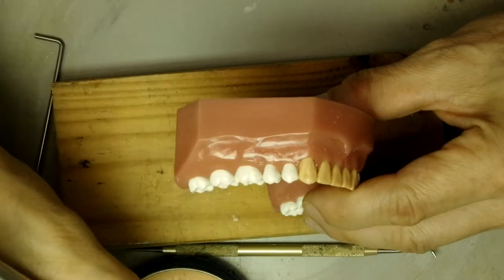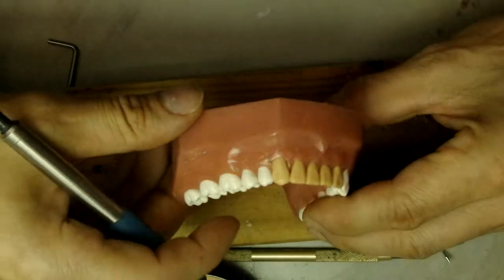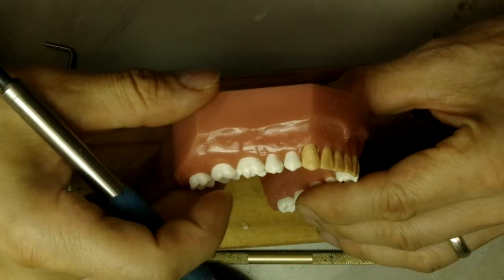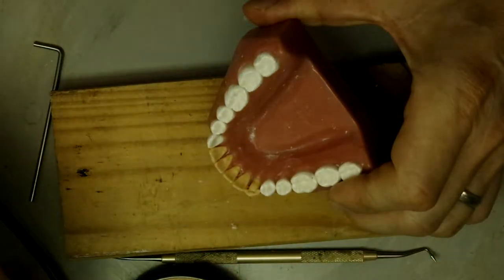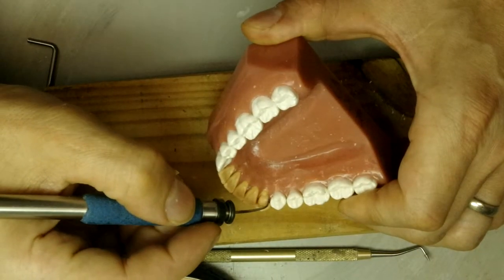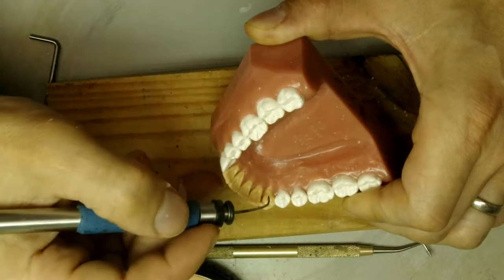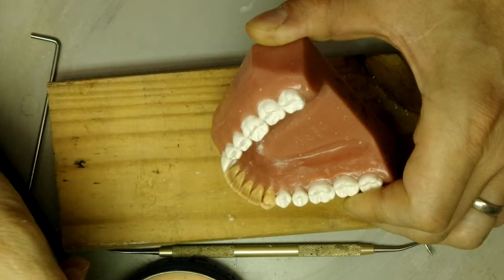Puddle it in a little bit. And that's our shape right there. It's almost very close. So now we're gonna do the lingual. Distal lingual marginal ridge, which is also the distal lingual line angle.